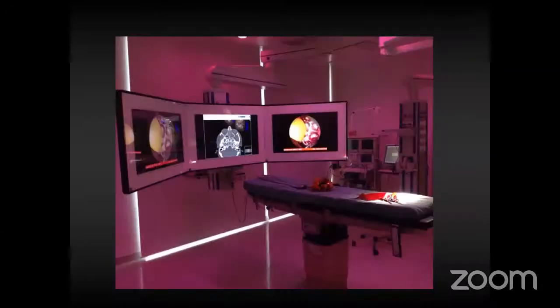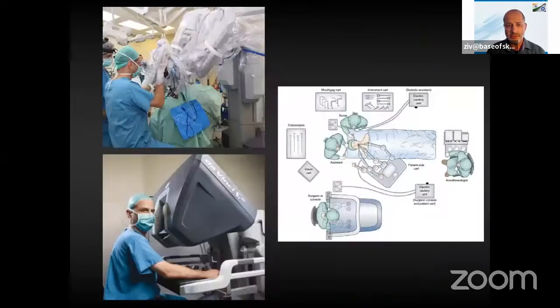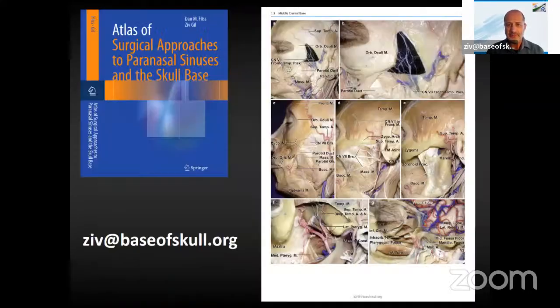To show you, this is our endoscopic suite at the institution. Usually we perform the operation with two surgeons' technique. As also in the institution, there is the Da Vinci robotic apparatus, which many of you are familiar with, which we combined also for removal of tumors, not only in the base of tongue, oropharynx, larynx, but also in the skull base, as you will soon see.